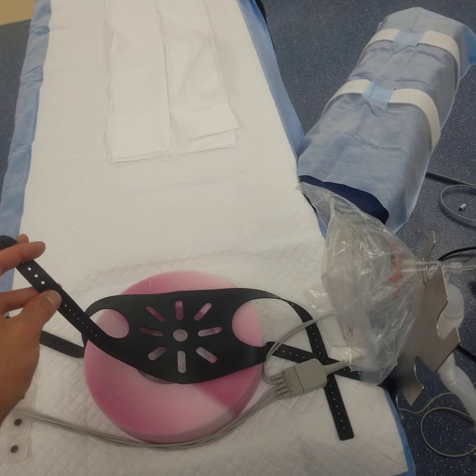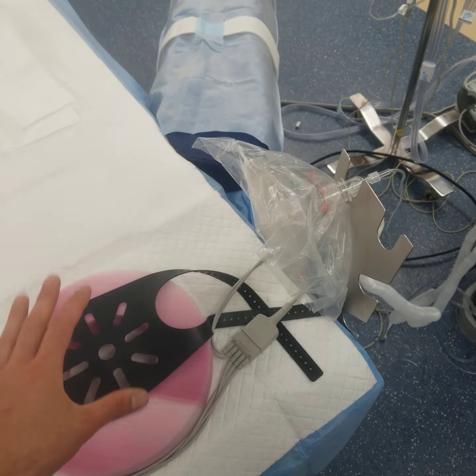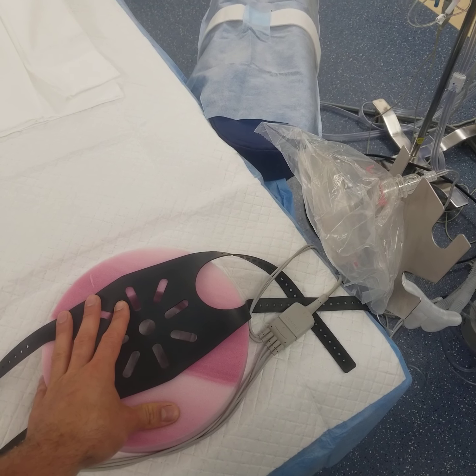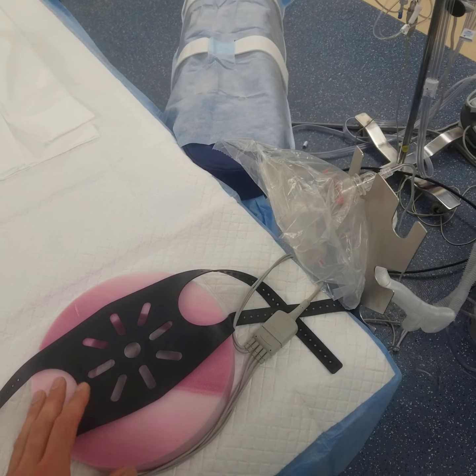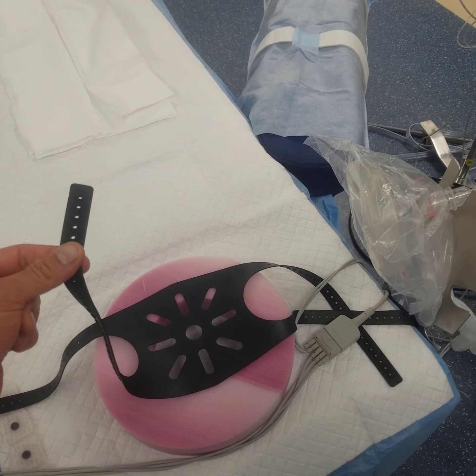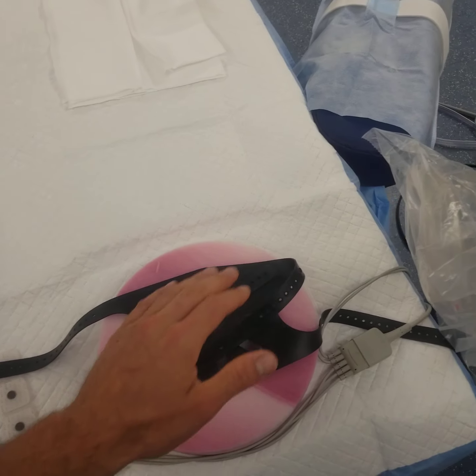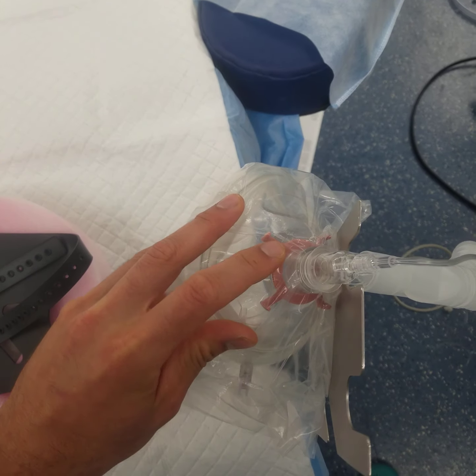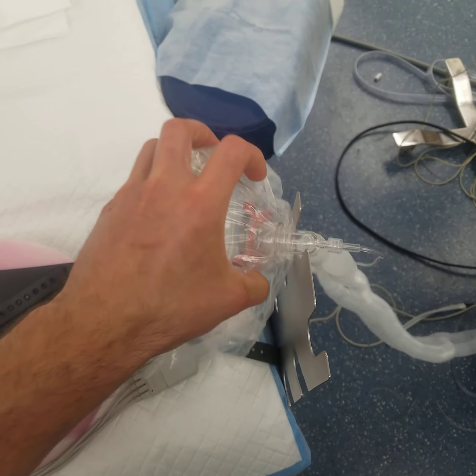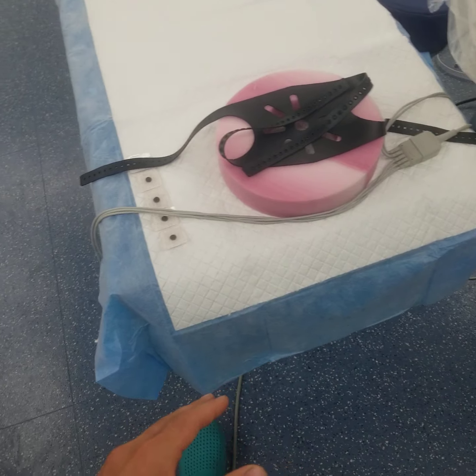I'm a big fan of using the mask straps. So what I'll do is I'll tell the patient after I hook them up, like, are you okay breathing some of my oxygen? You have no problem with the mask being on. And they'll probably say no, they're fine. So I lightly strap 2 of these straps on, and they actually hook right into these little clips right here. They loop right into there, and I just get this placed on their face so they're already pre-oxygenated. You're gonna look like a professional.